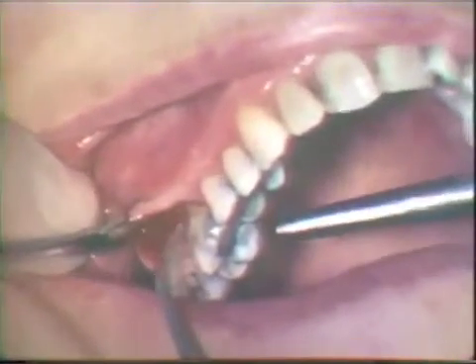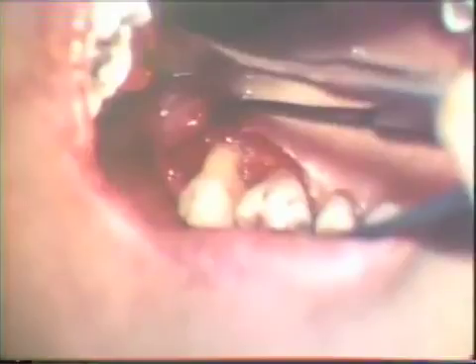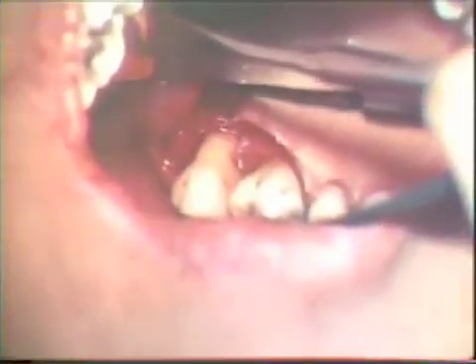The buccal flap is raised and the wound is irrigated with sterile saline solution. The roots and crest of supporting alveolar bone can be carefully inspected. Note the planed root surfaces. This mirror view shows extensive root exposure of the second molar. Note the well-planed root surface. The pockets did not extend into the distal lingual trifurcation.